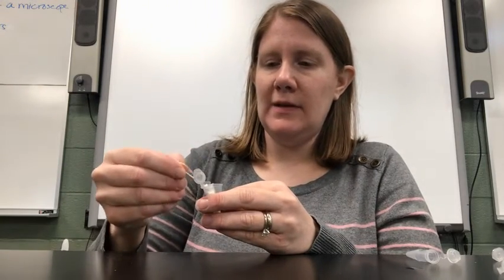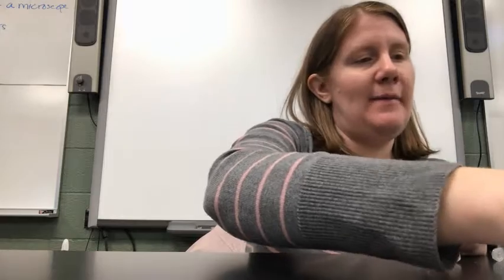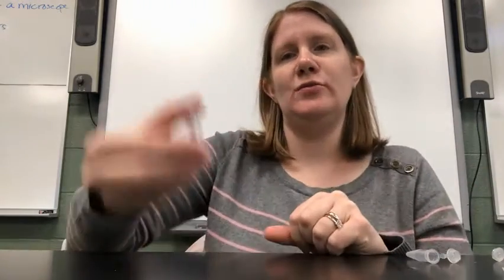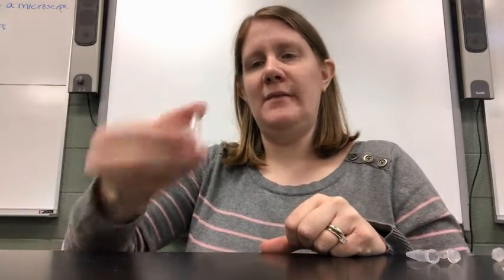I'll open up my sample. Going to put a little bit of my sample into the tube, close the sample, put that back in the envelope, and I'm going to close my testing tube and invert it to mix it.